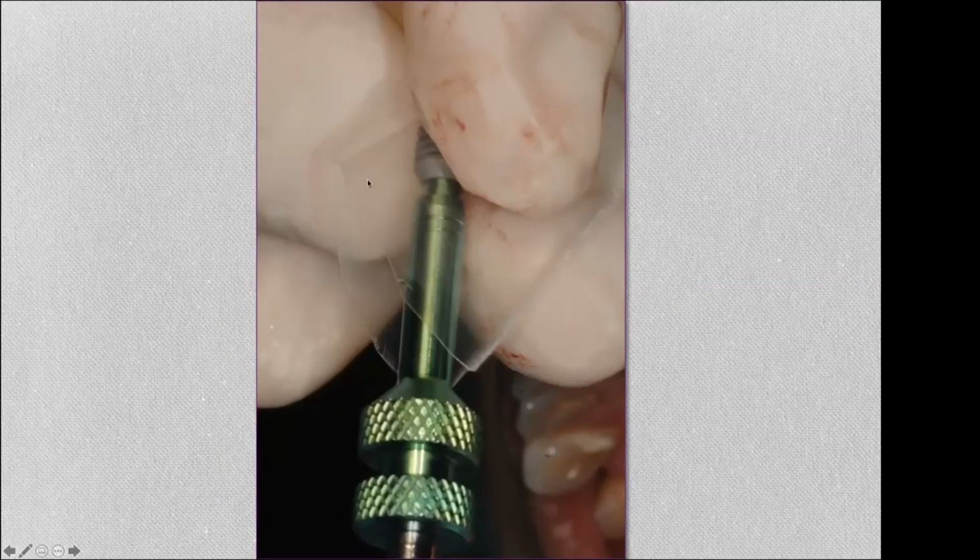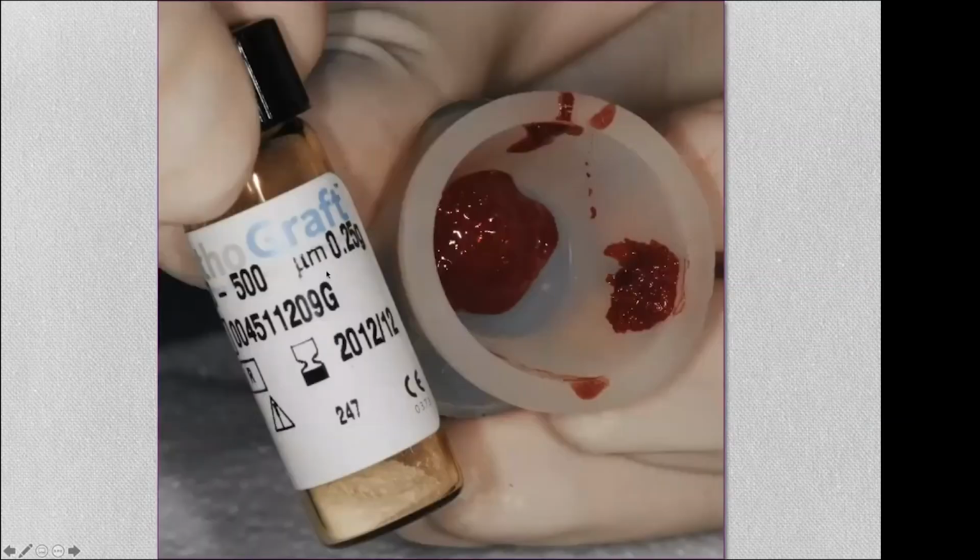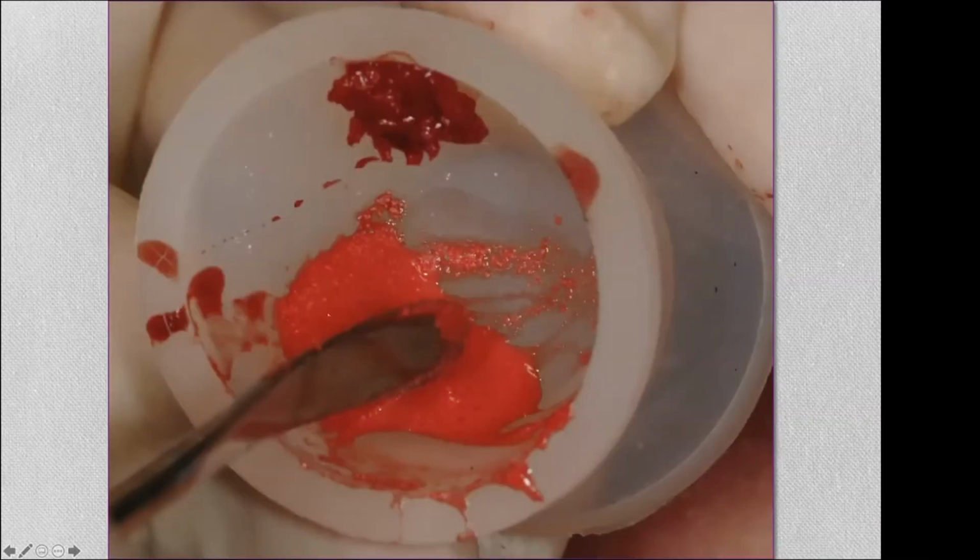Okay, prepare your implant on the inserter retriever. This is going to be a 5x6. Take your SynthoGraft. This is the 50 to 500 micron. This is the fine. A 1/4 gram is adequate for one tooth. Okay, mix it thoroughly until you get to this sort of mud or slurry phase. You want it to be more liquid. Now, for a bone grafting over an implant, you can have it relatively dry, but for a sinus lift, an internal sinus lift in particular, you want it to be kind of a slurry phase. So if you shake it a little bit, it has a little glisten on top and it settles with a smooth surface. That's the consistency you're looking for.